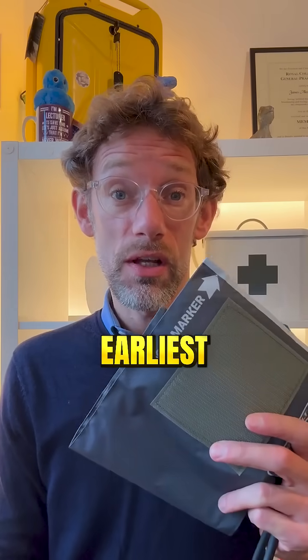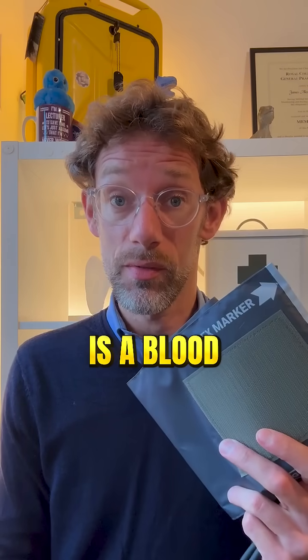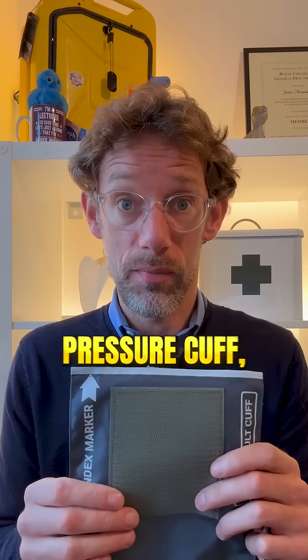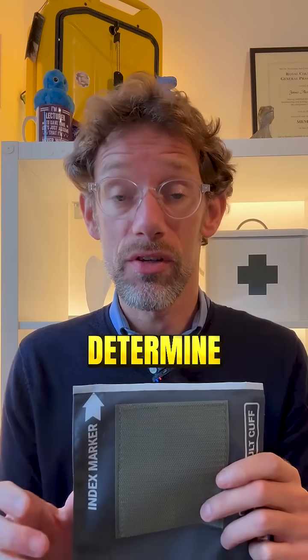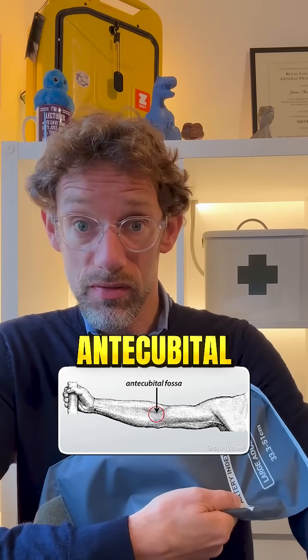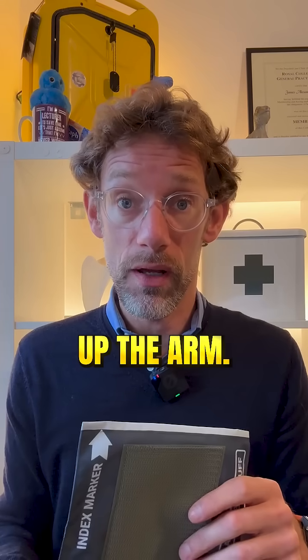When you start at medical school, one of the earliest diagnostic tools you'll come across is a blood pressure monitor. These are festooned with various markers on them. The first one we need to pay attention to is the index marker — a white bar running the width of the blood pressure cuff. We use it to help determine whether we have the right size cuff, placing that white marker between the antecubital fossa and the shoulder. The blood pressure cuff should have a width that covers two-thirds of the way up the arm.